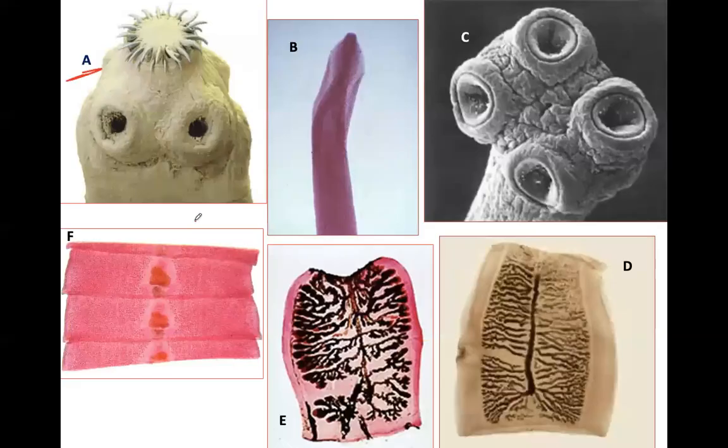Now let's keep going in the chat. Why do you think it is Taenia solium? What's the diagnostic feature? The rostellum. Aha, rostellum with hooks. Yes, not scolex. They all have a scolex; the scolex is a head, but the rostellum has hooks. Great, this is another defining feature. Hooks, and four suckers. So these are suckers: the four suckers with a rostellum that is armed.